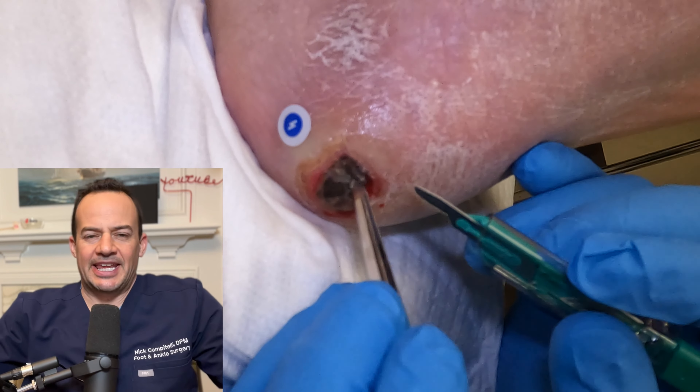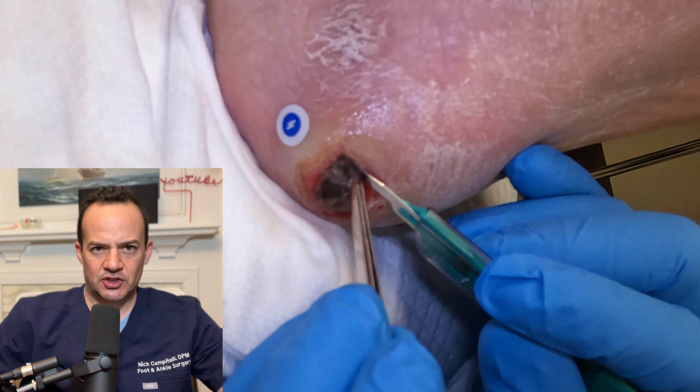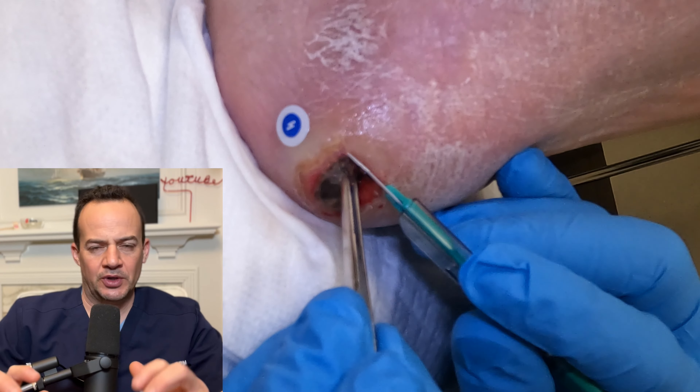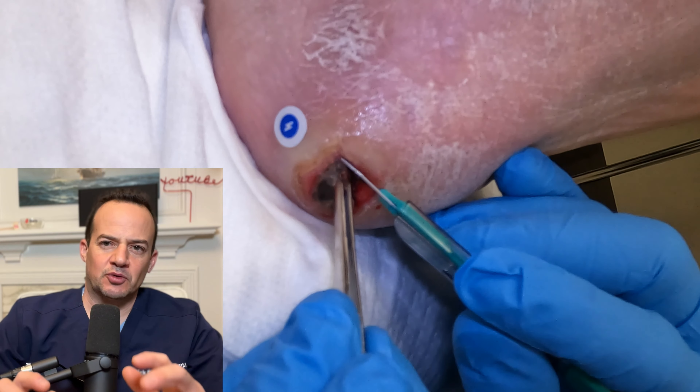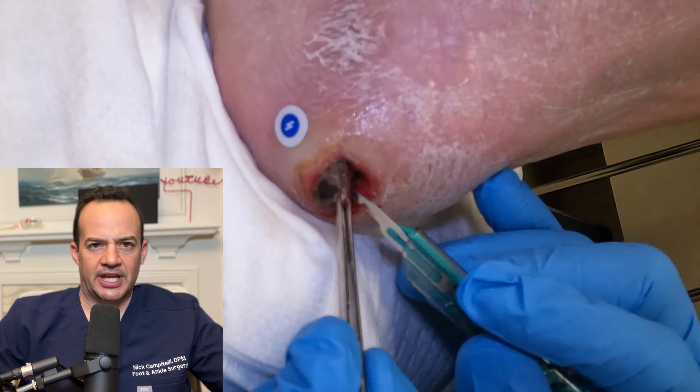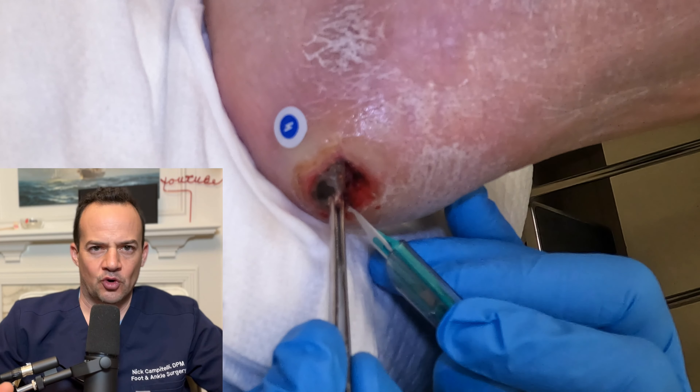I am debriding, or cutting away the dead tissue from an ulcer on this patient. This patient has diabetes so they can't feel the wound, and what you're seeing here is we're removing an eschar. This can also be called an escharectomy, where we're taking away the eschar that's forming on the ulcer.